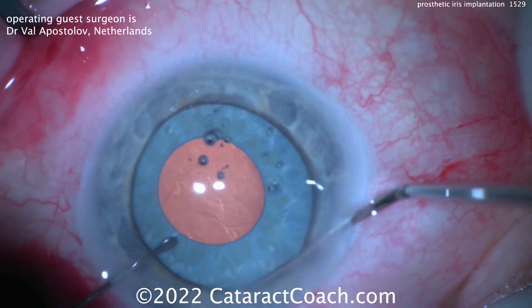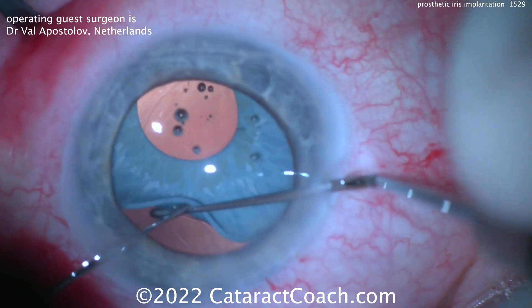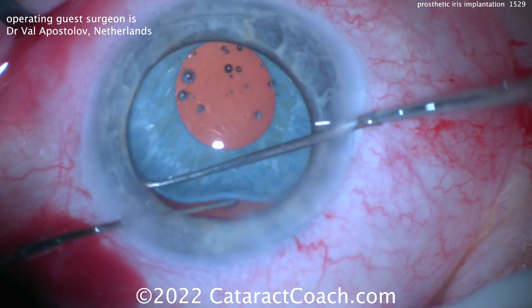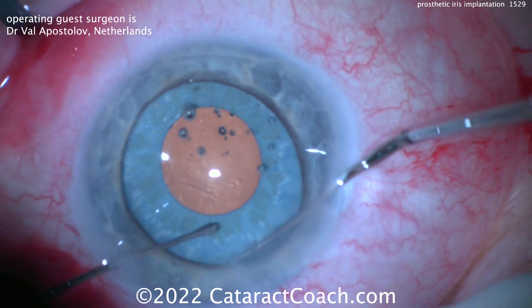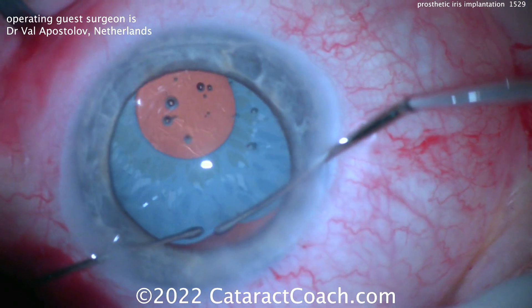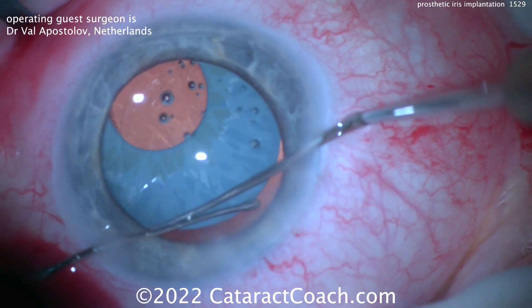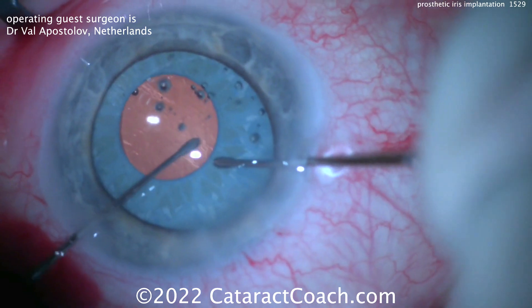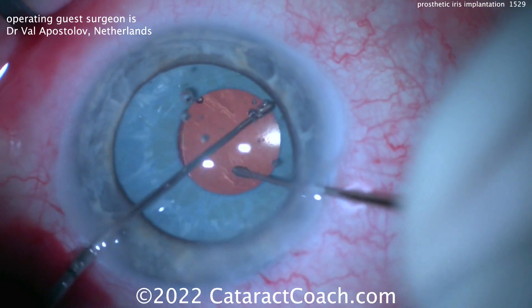Once you get it inside — look at that — it centers up quite nicely, and this patient has a pretty nice result. Take your time and make sure it really is complete in the capsular bag. Hard to see the rhexis edge here, but it's looking pretty good — just this one last area to get in the bag, and once that happens, you're home free. These patients can also have other comorbidities such as glaucoma. Now you've got a beautiful result. Thanks for sending the video in — always fun to watch.